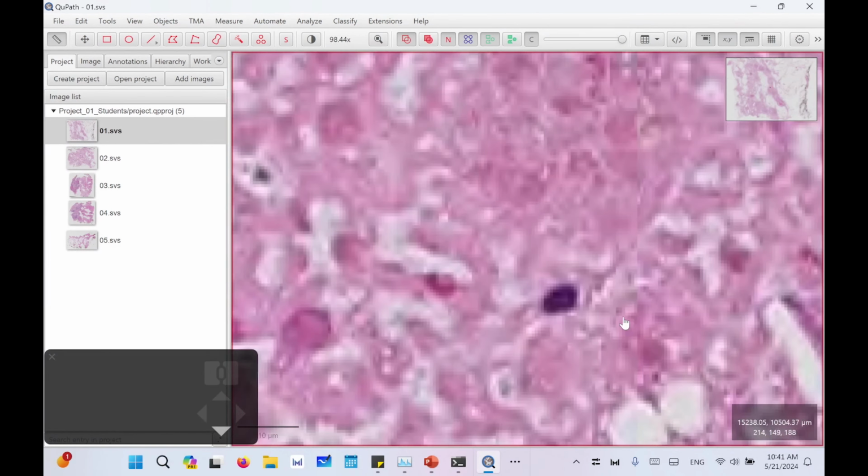When you press on the eosin sign, you will find the cytoplasm and the extracellular structure displayed. You can also press show grayscale to display a grayscale image. By looking, you will find different nuclei here. You can also change the channels' minimum and maximum.